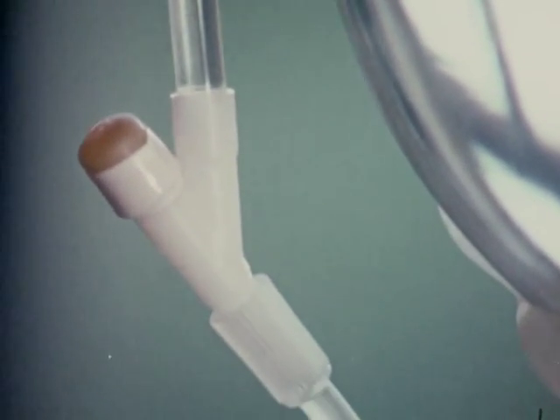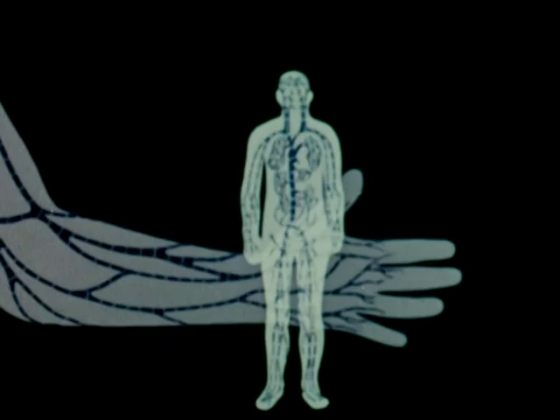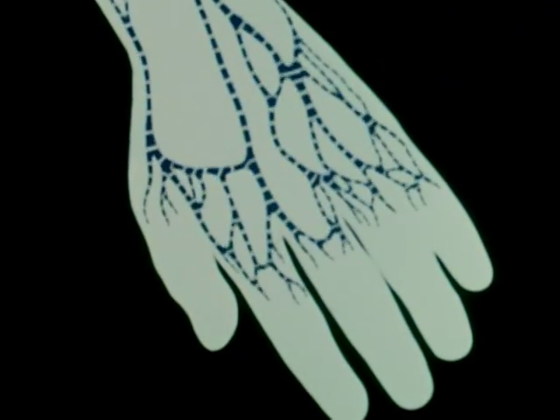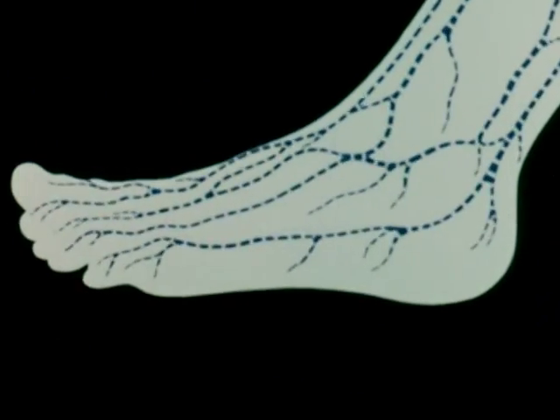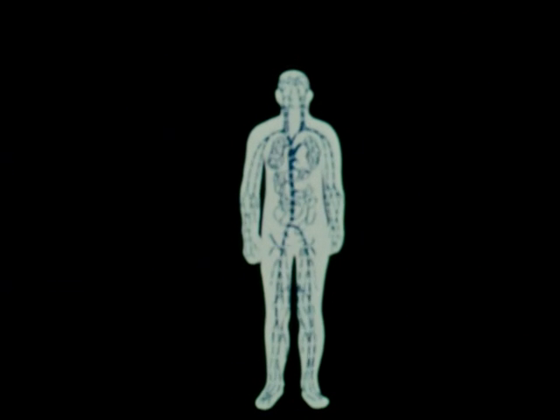The set is now ready to be passed into the circulatory system, and you must decide from which point in that system. Although most superficial veins are suitable for entry, the preferred sites are the anterior aspect of the forearm, the radial side of the wrist, the dorsum of the hand, the veins of the antecubital region, and occasionally the veins in the dorsum of the foot or at the ankle. Entry at all these sites is relatively simple and becomes even more simple with practice.